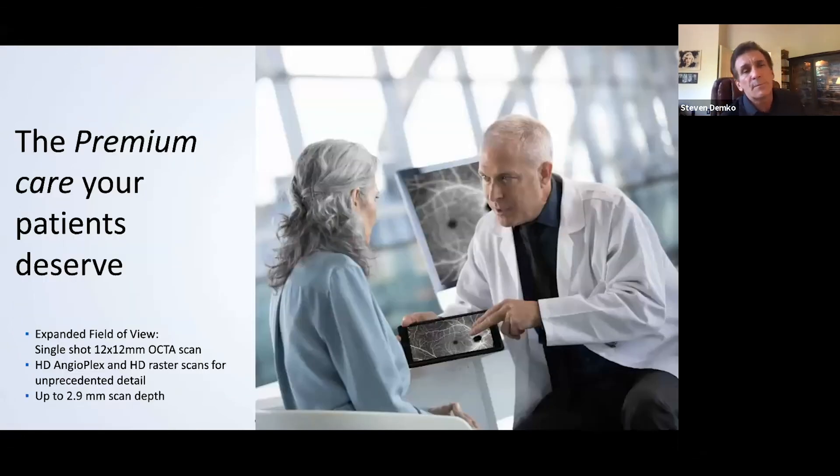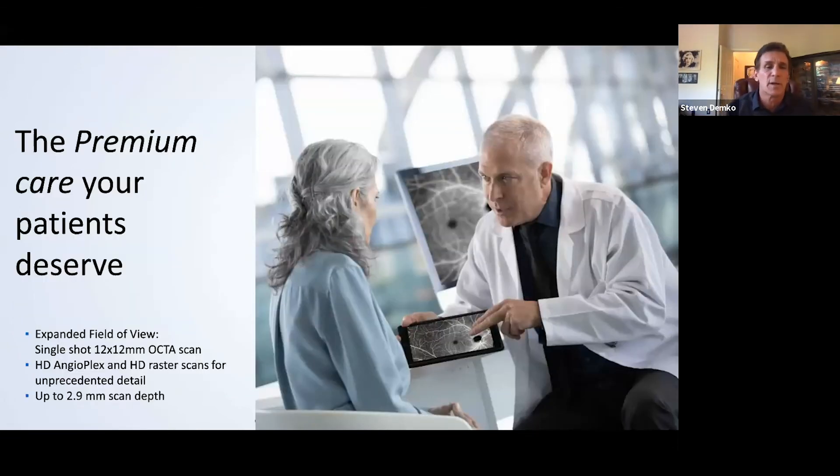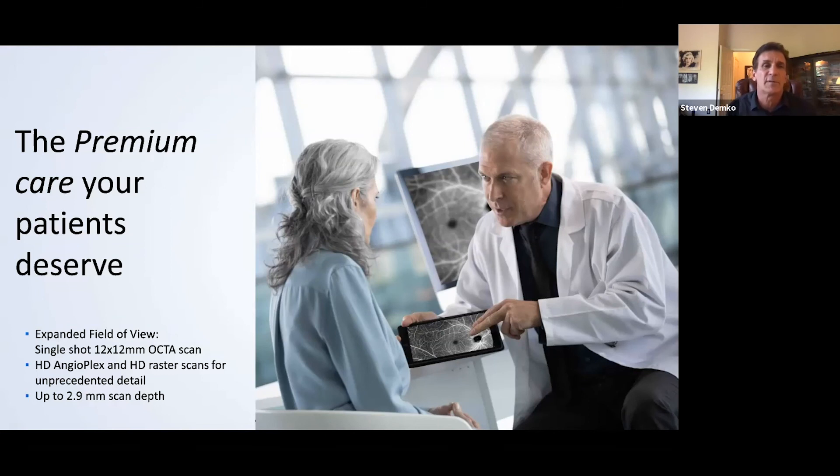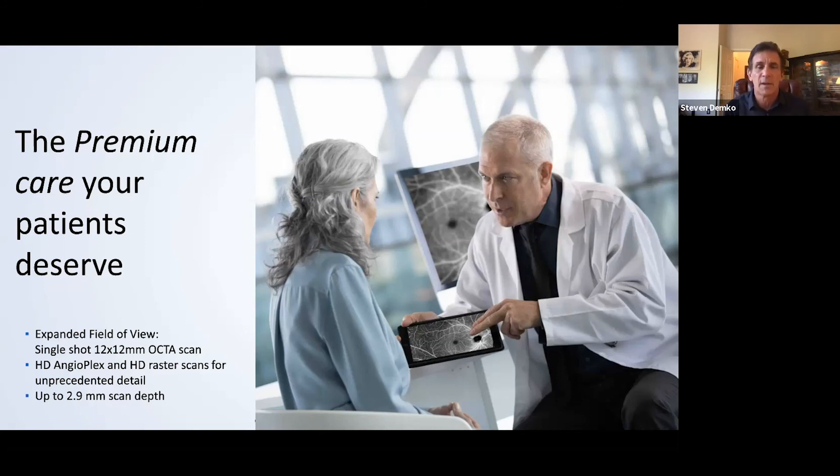So your patients, you, your patients, your staff, they deserve this. They deserve the best technology, and Zeiss does provide the best technology.